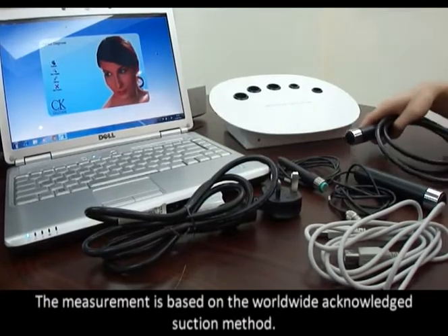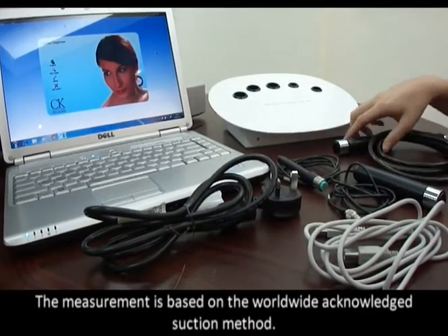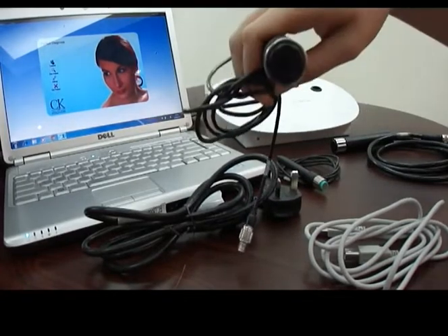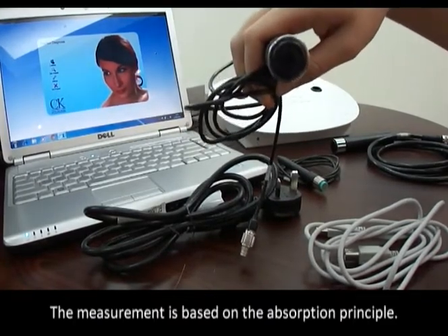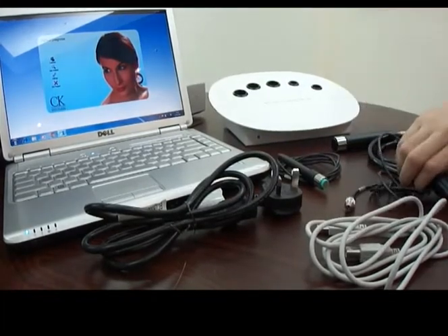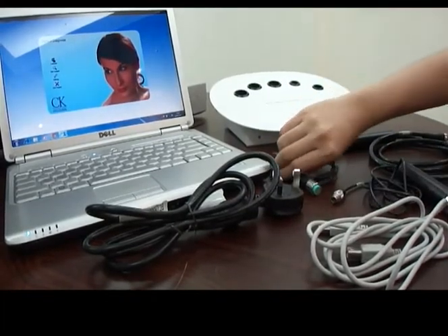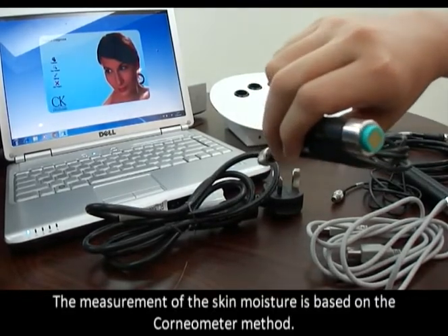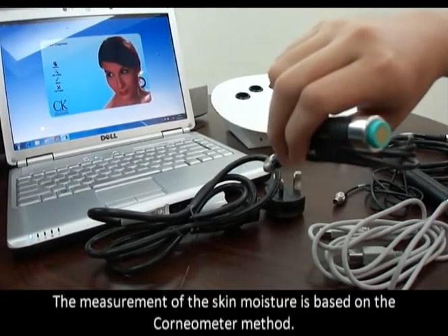The elasticity measurement is based on the worldwide acknowledged suction method. The melanin measurement probe uses the absorption principle. The moisture measurement tool measures skin moisture based on the cornometer method.